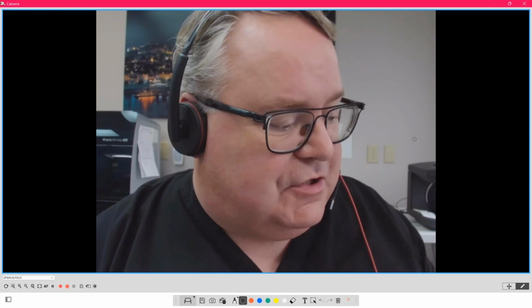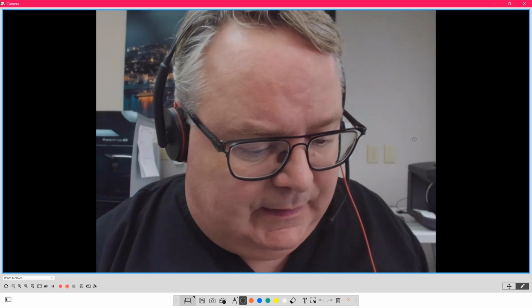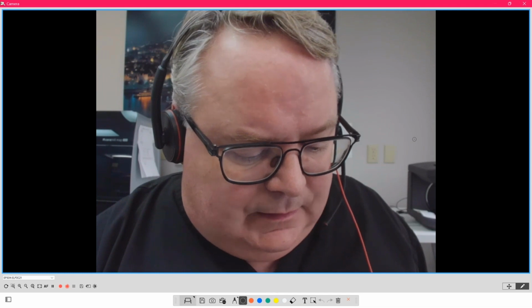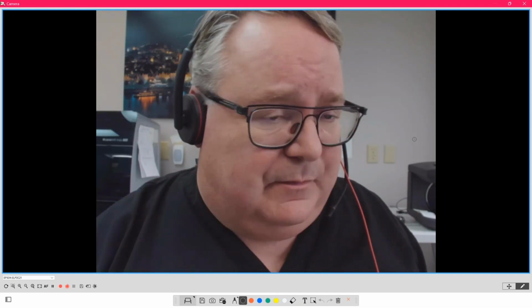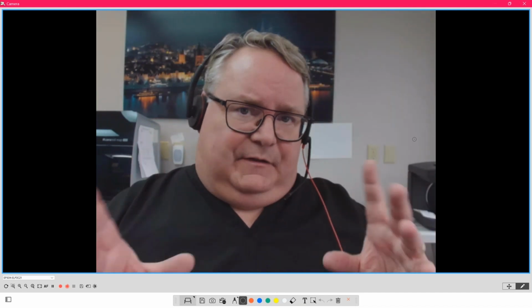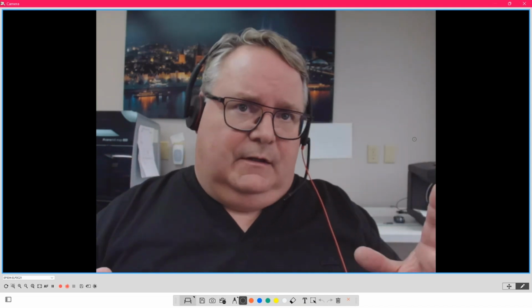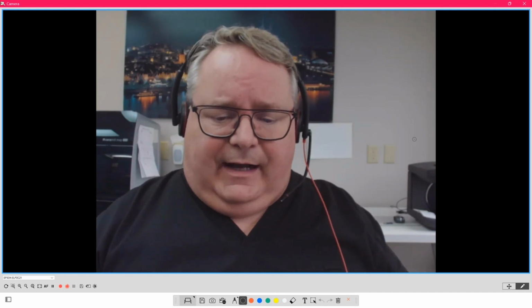Yeah, there was a question about the PhysioDens, so thanks for bringing that up to our colleague. Basically, from a digital perspective, it's the same thing digitally. As our technology is getting better with digital, we can adjust the guiding planes and have that milled out for us prior, and that's going to help. Otherwise, you still have to do it by hand after the fact.